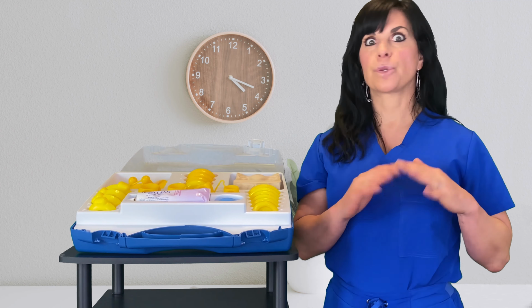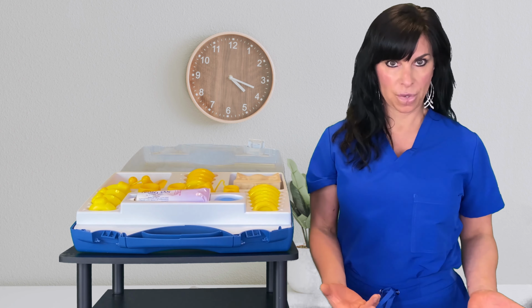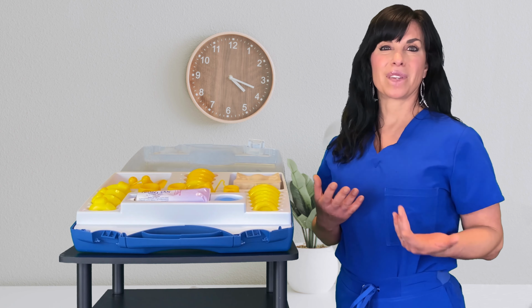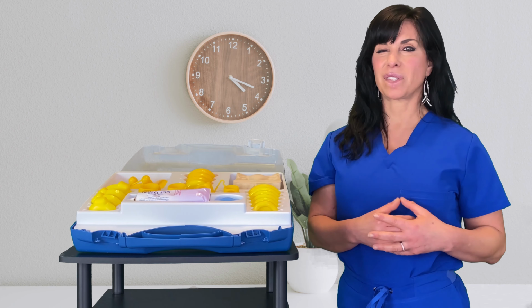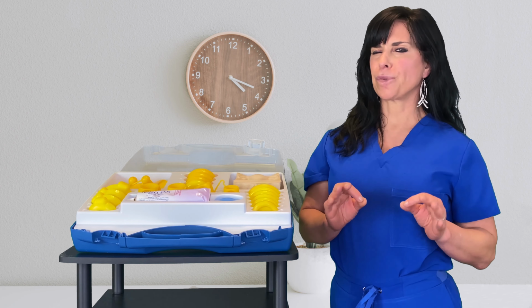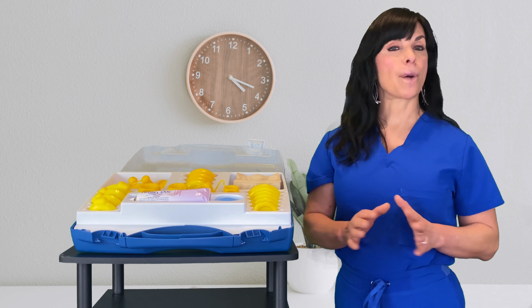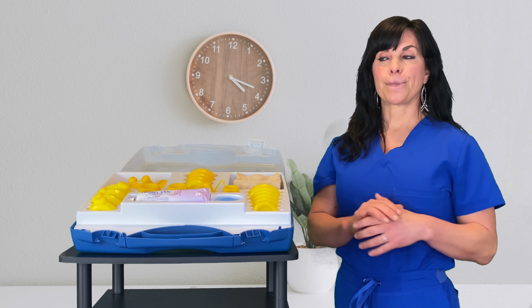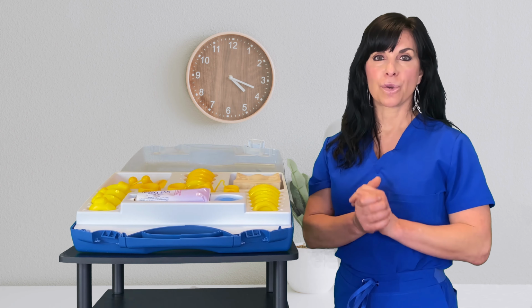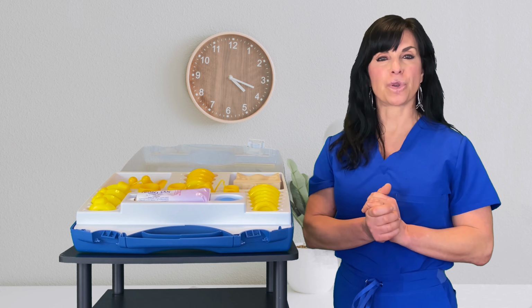And we call it a trial because we don't know if it's going to work. Most of the time we get it right on the first fitting, but sometimes it doesn't work. Sometimes it falls out while you have a bowel movement. Or sometimes it's fine in the office, but all of a sudden it's painful at home. So when I say that last part, painful at home, it's very uncommonly going to be painful. I probably can name maybe a handful of patients that have had pain with the right sized pessary.